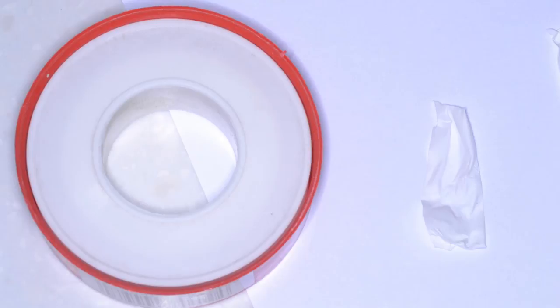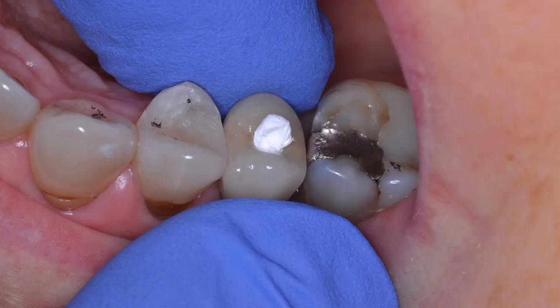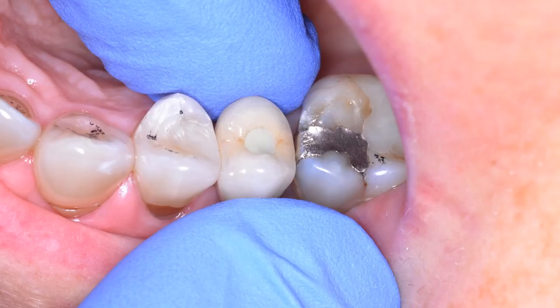So you can see here the Teflon reel. We've cut a piece of the Teflon off, and in the next photograph you can see that we've adapted this Teflon into the orifice of the screw retained crown. What I'll generally do, after etching the screw retained crown, washing the phosphoric acid out and drying it off, is put the Teflon plug in and use the tip of a flowable composite syringe to pack this down. Then I take some bonding resin, apply that around the margins, and then place some flowable composite on top. In the next photograph you can see what the final result looks like, once again checking your occlusion in centric occlusion and also in excursions to ensure that there are no non-working interferences for this particular case.